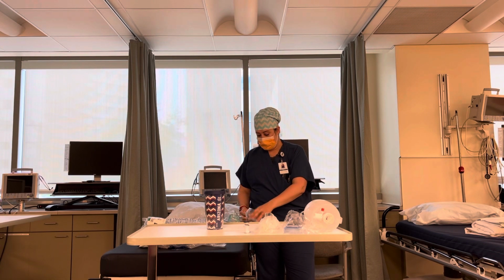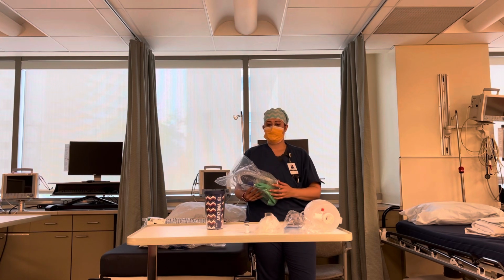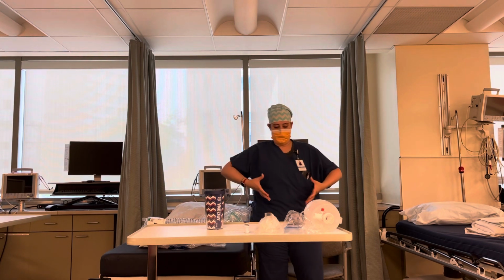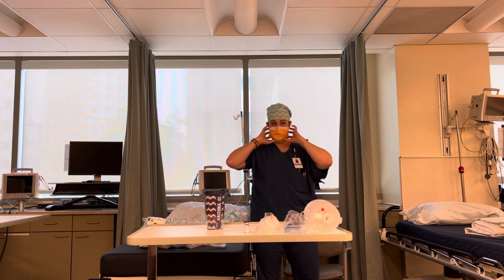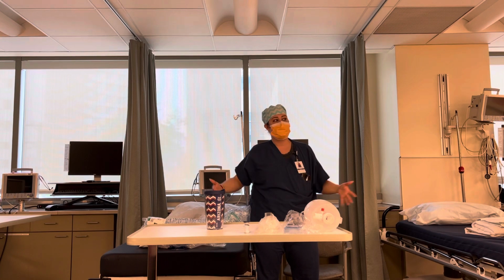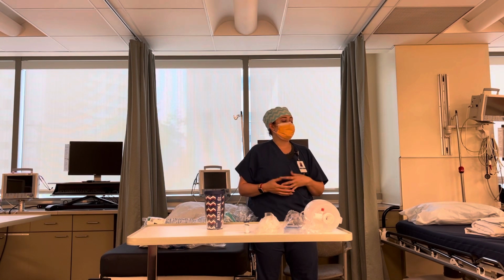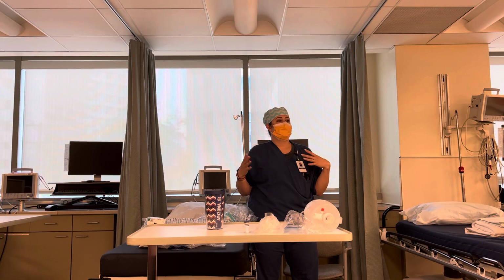Crank the O2 up to 10 when that happens? Yeah, just crank it up. Yep. And then we will probably need both of our hands to hold the mask, a good mask seal to fully give that pressure. So then we may direct you to help us squeeze the bag. So just be ready and listening for us to give you directions, just like in a code, right? You're just waiting for somebody to tell you what your role should be.